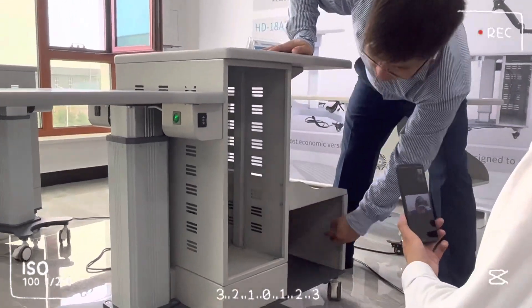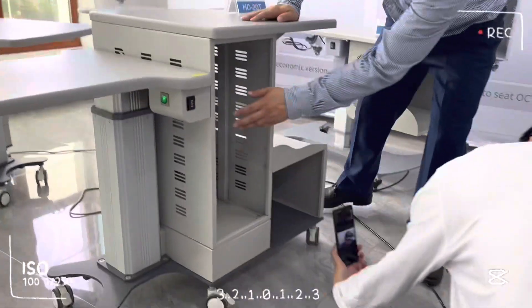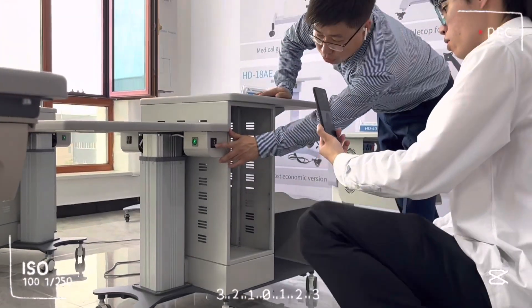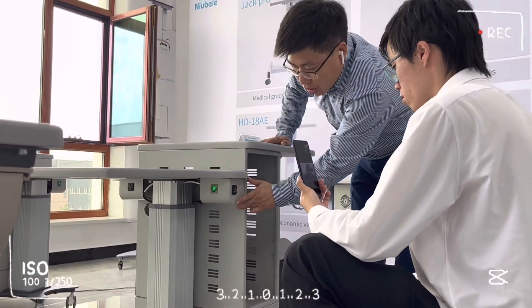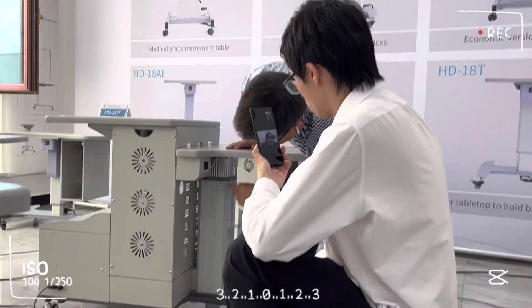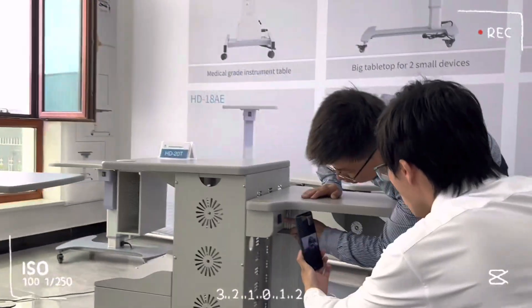This side there is a socket for the power supply, and we have that. We got the main power switch over here, and then we have our power supply from over here.